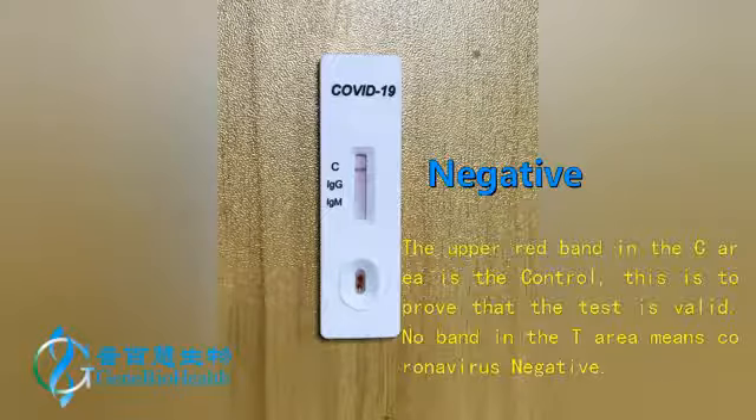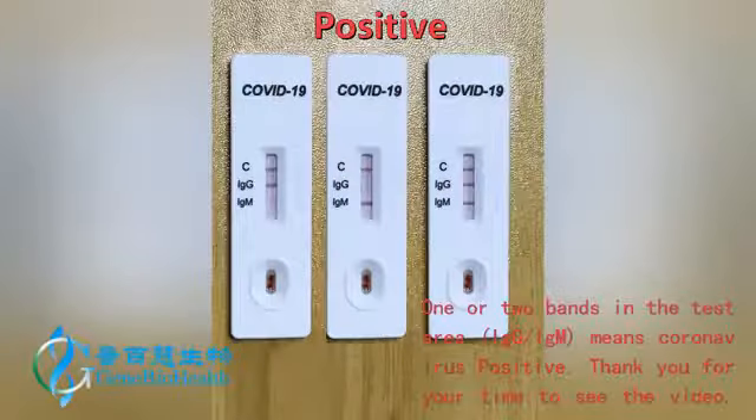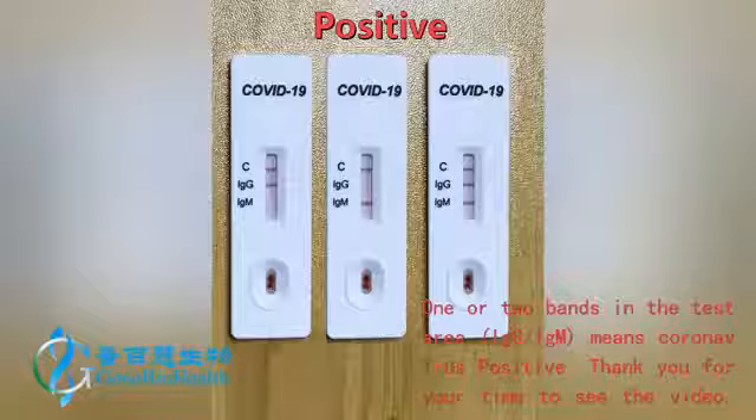The upper red band in the C area is the control — this is to prove that the test is valid. No band in the T area means coronavirus negative. 1 or 2 bands in the test area, IgG IgM, means coronavirus positive. Thank you for your time to see the video.